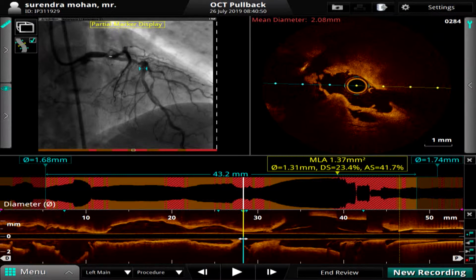Yeah, my only concern, two things. One is, if you're thinking the circ is a large dominant branch, then a 2.5 is likely not the adequate size for it. And if you thought that that was the right size, then I would recommend doing an imaging run first to be sure of that. And the second is we just didn't get a chance to study the films enough to determine how much the circ itself is actually supplying, because it was a very quick shot of the right, so it's not clear to us from here. I don't want to make you go back and forth and do it that way. But I think if you're going to do the circ, we'll image it if necessary. We'll do an additional dilatation.